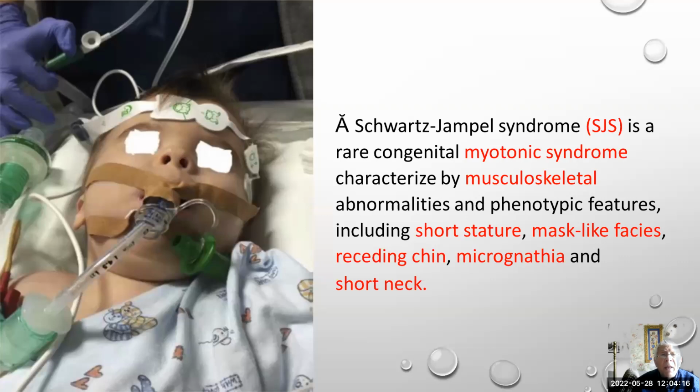Of course, during manipulation and introduction of the supraglottic device, we must make maneuvers so that we will succeed. In other words, we can flex the neck, we can put the neck on one side and the other side. All these are maneuvers to succeed. And there are many studies about the oropharyngeal leak pressure during such situations.